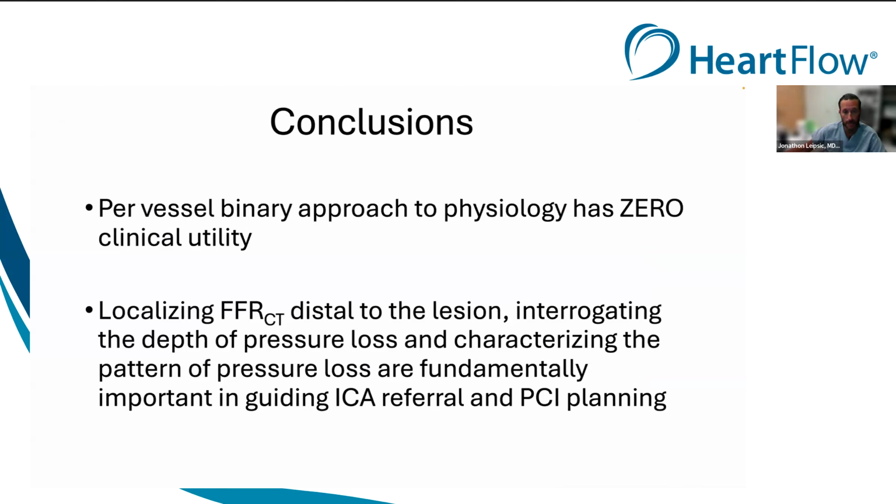We'll pivot to atherosclerosis, but I just wanted to close with lessons that I've learned over the last 7 years, that essentially per vessel binary physiology has almost zero clinical utility in my practice. I can predict that the LAD is likely to have abnormal physiology in the distal vessel when I see diffuse disease in an anatomical lesion.